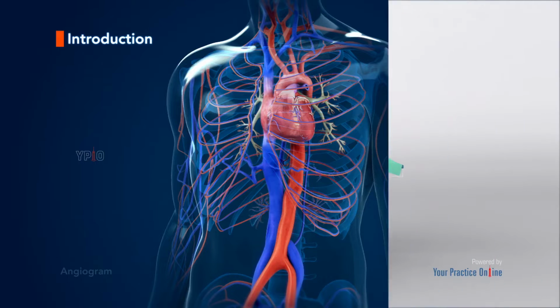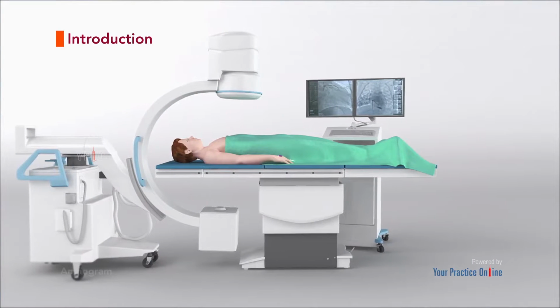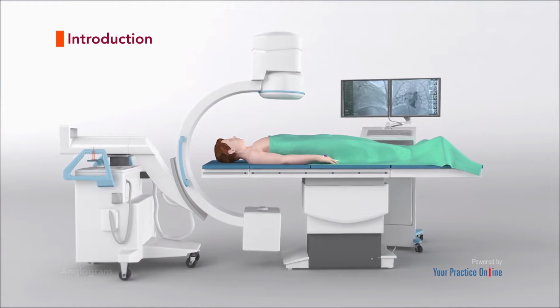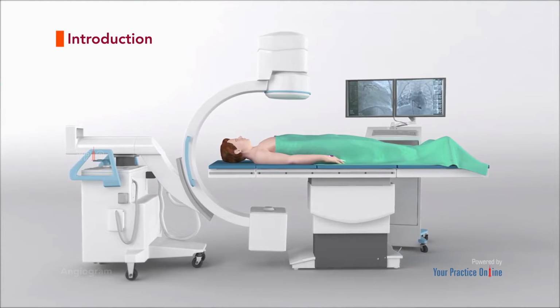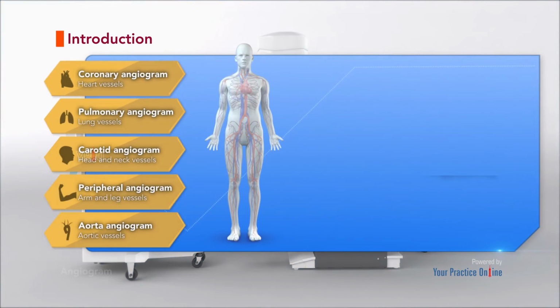An angiogram is an imaging test that uses a special dye and X-ray images to take pictures of blood flow in arteries and veins. There are several types of angiograms, each named after the body part to be viewed.